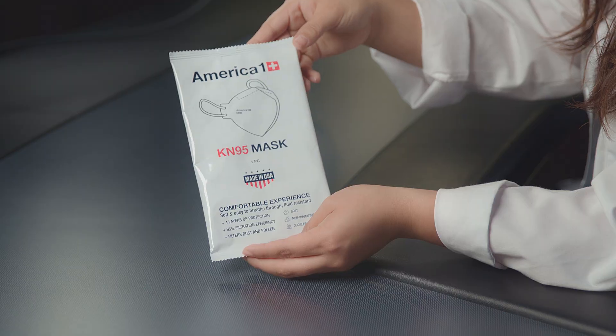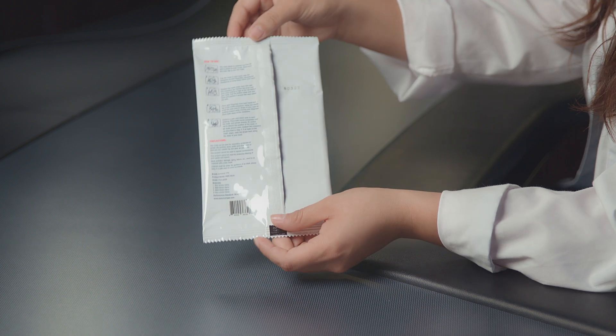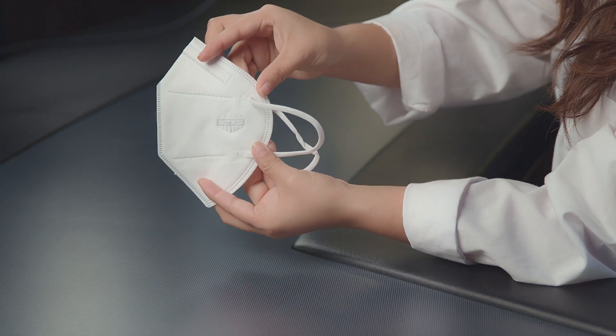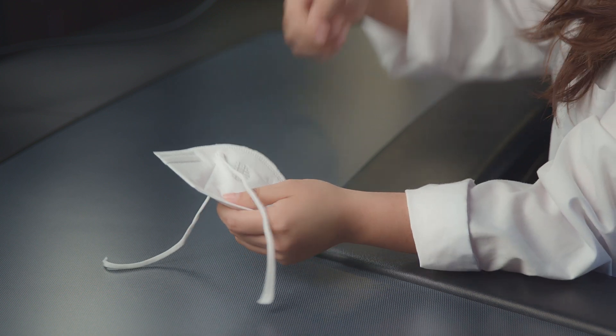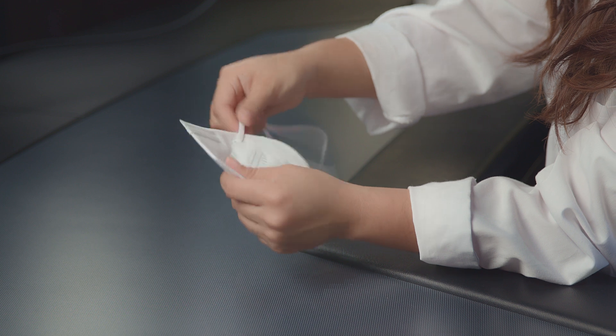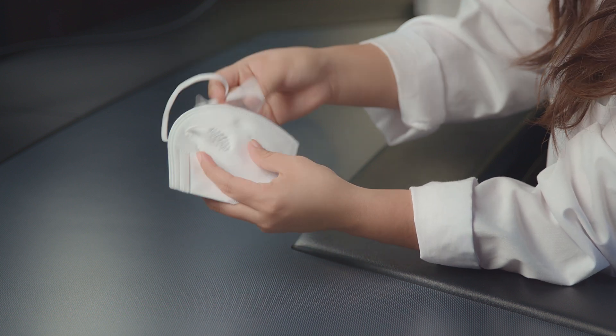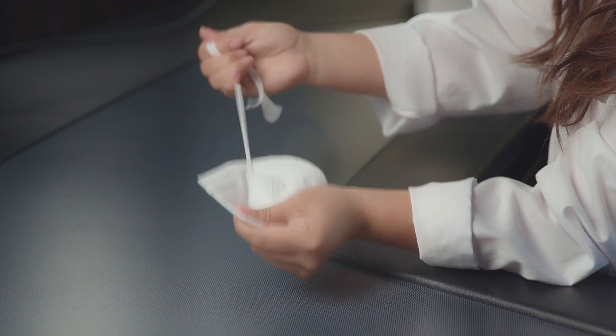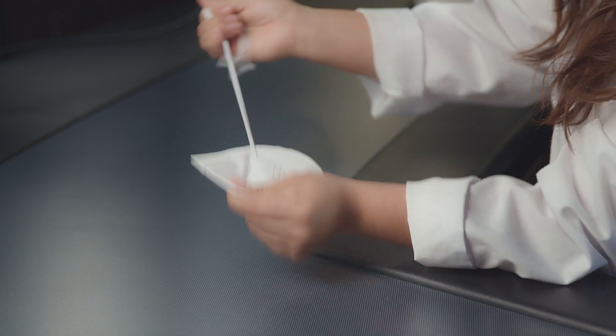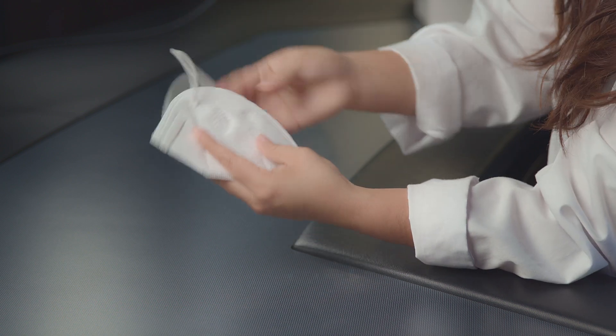Let's go ahead and take a look at these masks before we run them through our TSI machine. This is how they look — they do come individually wrapped and are on the thinner side. Let's go ahead and pull on these... okay, these are not very strong. I didn't pull that hard and the bottom ear loops came out really easily, though the top ones held.